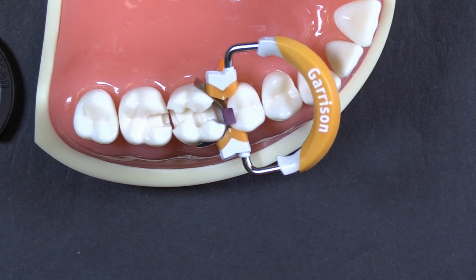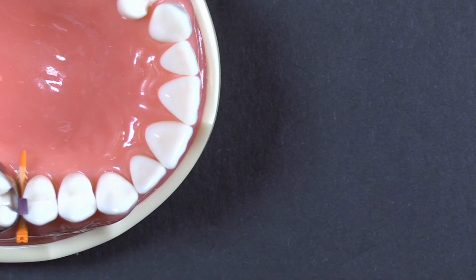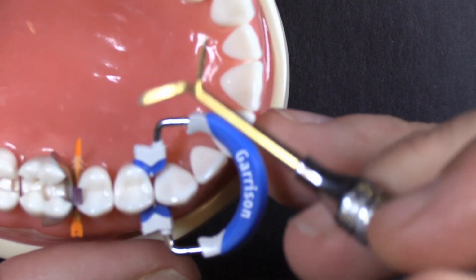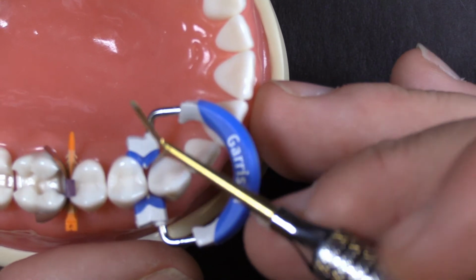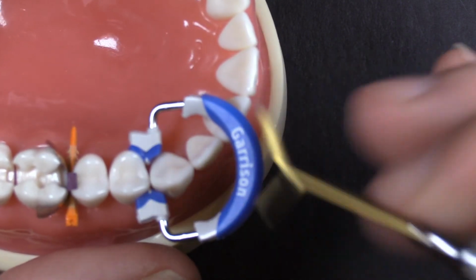So, canine and bicuspid fit. Again, there is a limit to what you can do with the sectional. They will go up between the canine and bicuspid. What you will find is less ideal of an adaptation on the canine. The bicuspid, as you can see, you've got really good adaptation here.